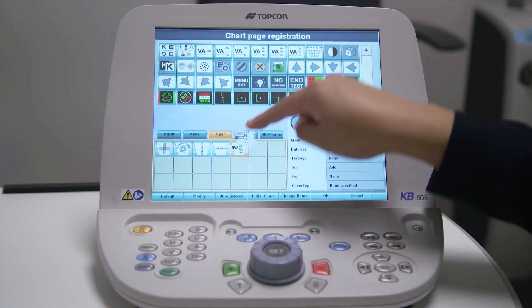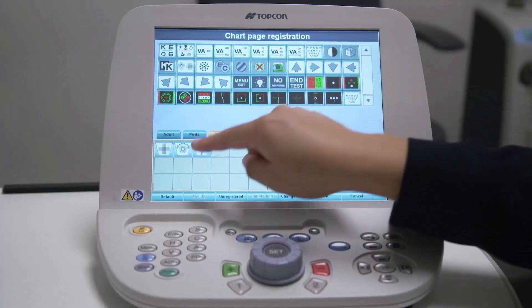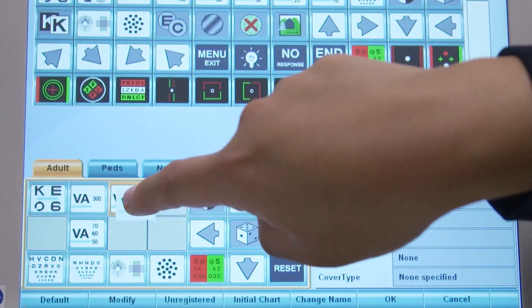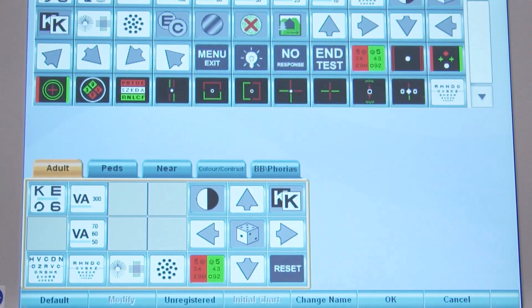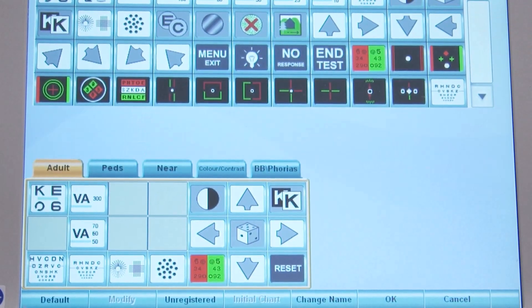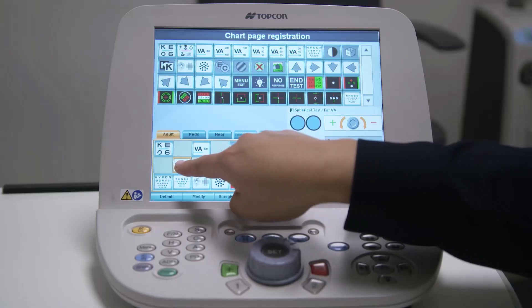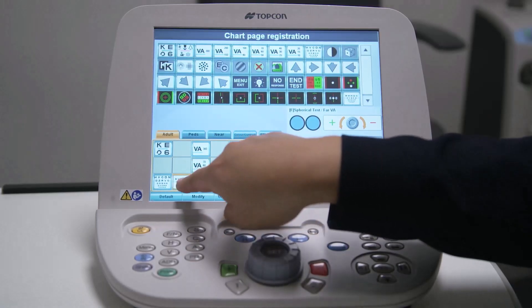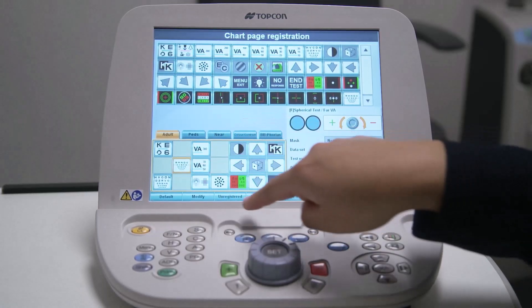Once you have named all the tabs, it's time to choose what charts will appear under each tab. Start by removing any charts that you do not want under this tab. Touch and drag a chart icon outside of the tab area, then release it to remove the chart from the tab. Don't worry — if you make a mistake, you can always add the chart back in later. Keep doing this until you have removed all of the charts that you do not want to appear under this tab. You can also move a chart icon from one slot to another under the tab.